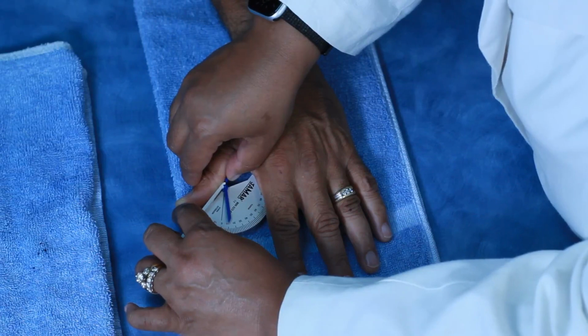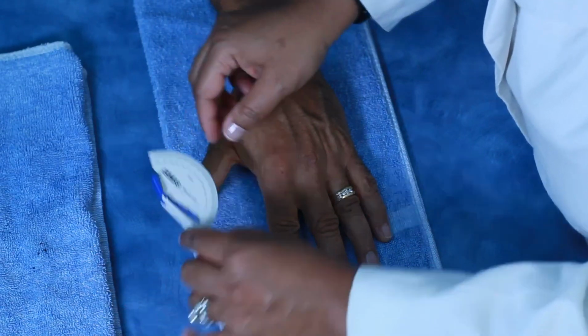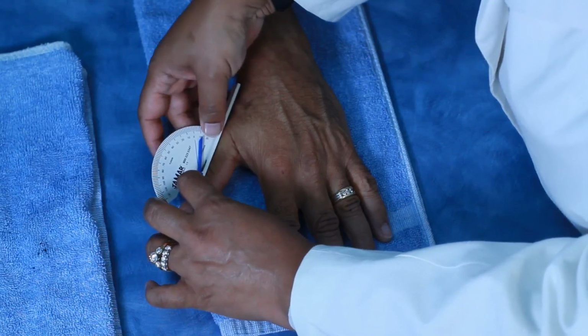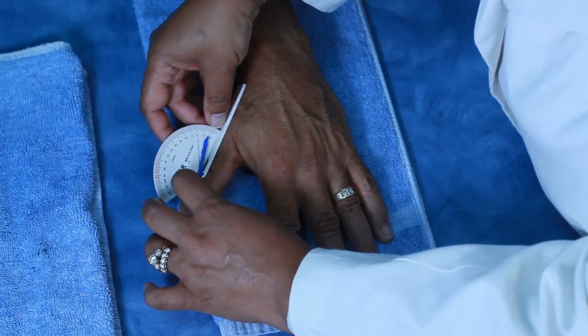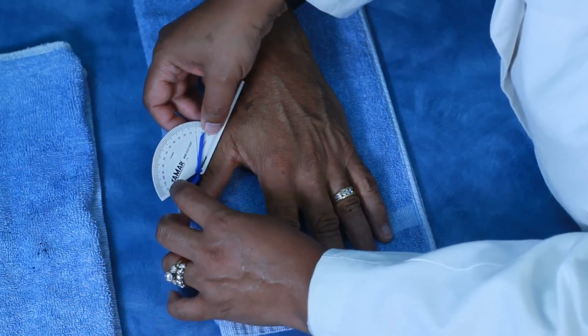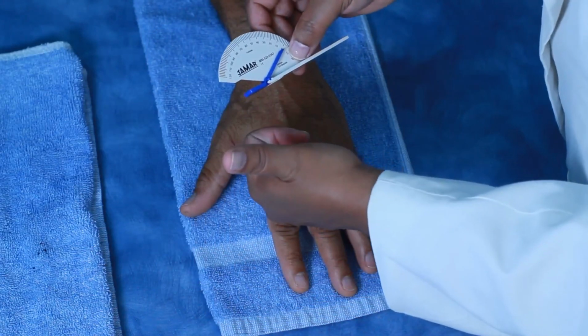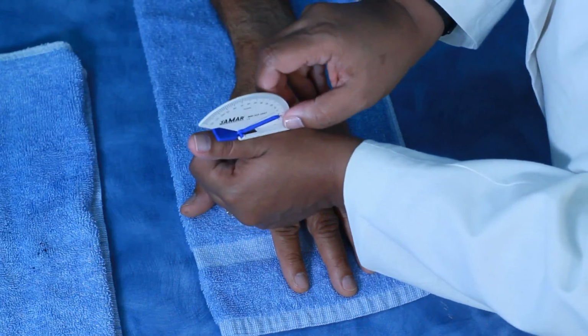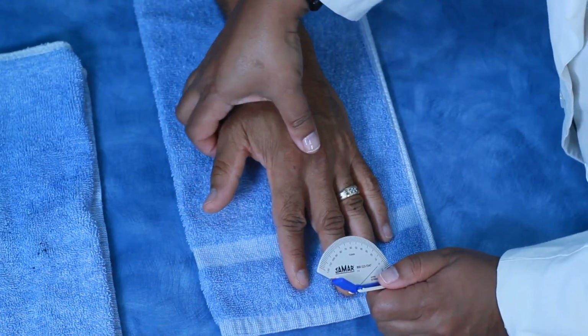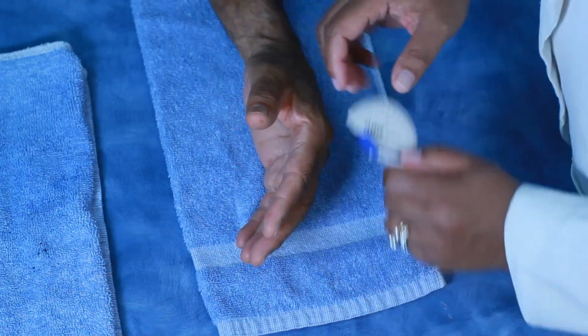So you're looking at about 10 degrees there of hyperextension, and I'm measuring it on this side because sometimes it's hard to get the area that you want. And again, you can see it here on this side on him. But if you had someone who had maybe 25 degrees, it might be a little bit more difficult to get that.